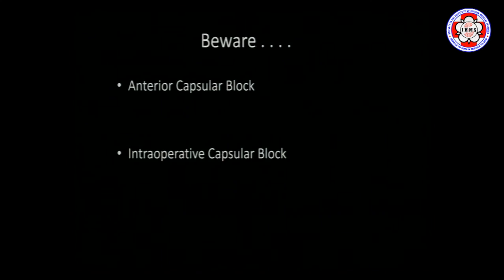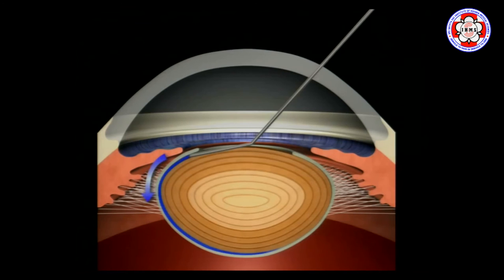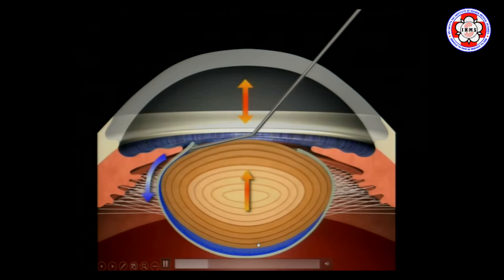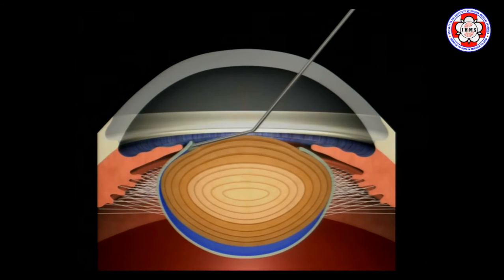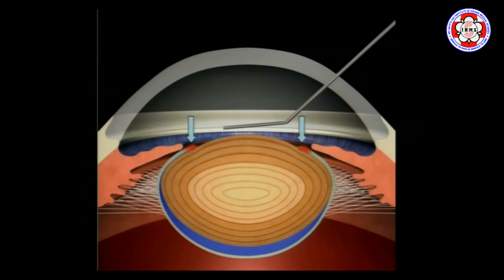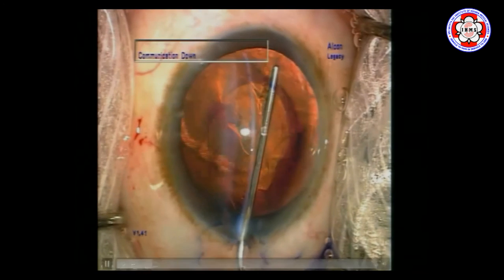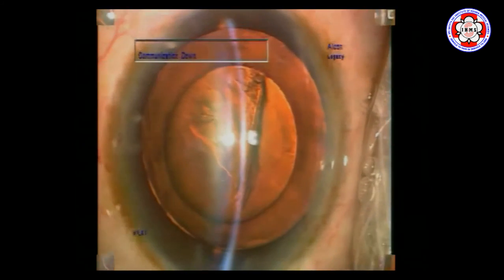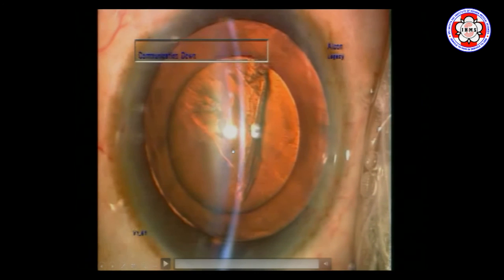One thing to be very aware of is anterior capsular blockade — what we call intraoperative capsular blockade. When you inject a hydro fluid wave, the whole lens tends to bulge upwards. If the capsule is tight or the lens is large, or the capsulorhexis is small, the edges of the rhexis will be blocked by lens material and the fluid wave cannot pass completely. Clinically you will notice a sudden shallowing of the anterior chamber and a tense, taut globe. Notice how the lens comes up entirely and the capsulorhexis enlarges because it is pulled by the lens substance, and the anterior chamber has completely shallowed.